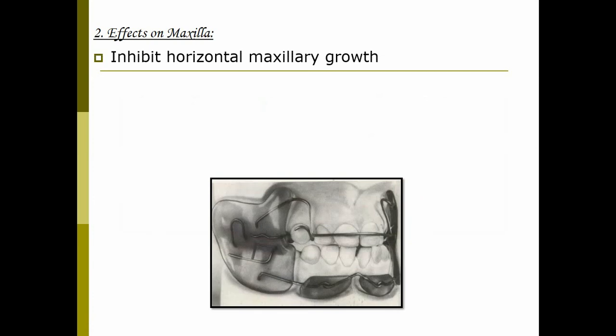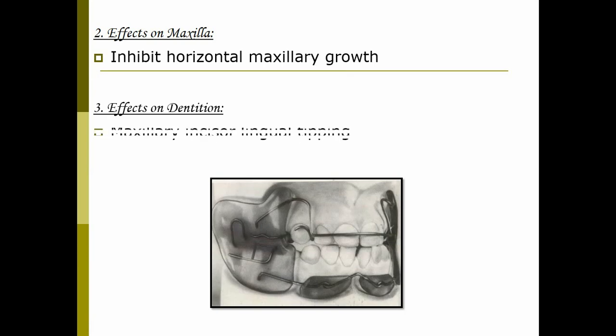That means we want to grow the mandible and we want the maxilla to go back, because mostly we give myofunctional appliances for class 2 patients, only rarely for class 3. In all the books, whatever effects you find are generally given for class 2 skeletal base correction only. Of course there is going to be a reverse effect if you are giving an appliance for class 3 correction, so please don't get confused.